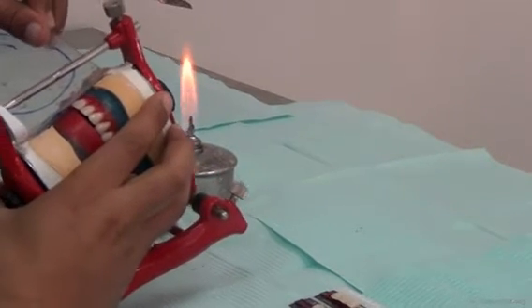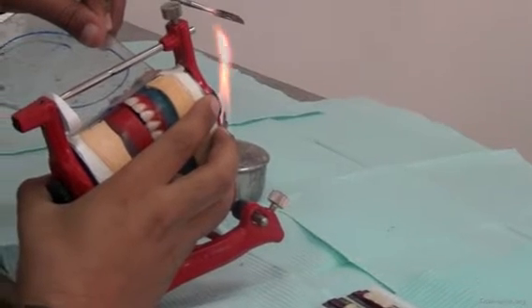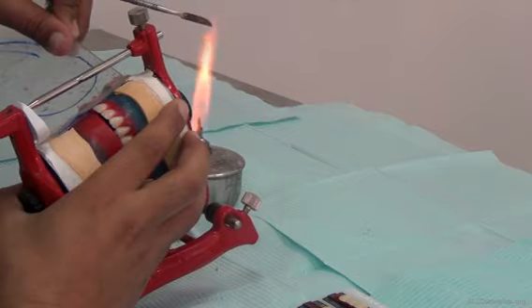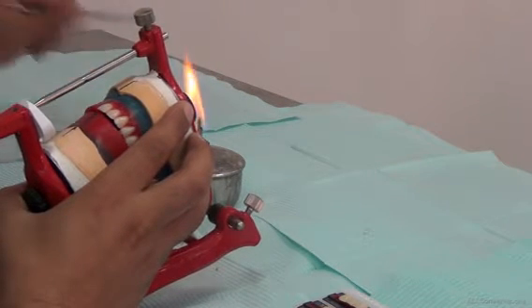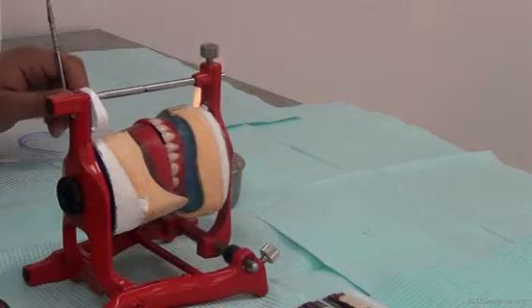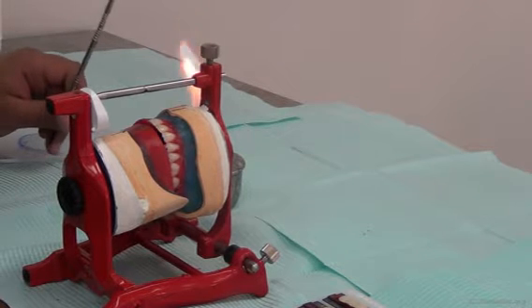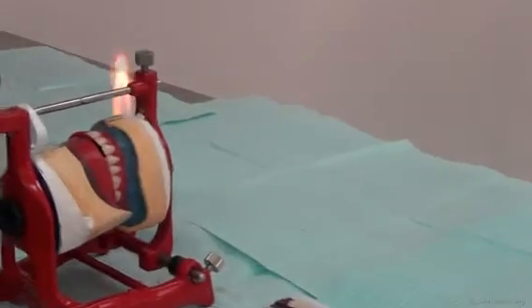As we told you in the first video, we are going to use cast-to-cast midlines as reference for your training, to overcome any problems with the articulator or any problems in your clinical skills in determining or drawing the midlines on the wax. And second, because the wax will be molten, we will lose the midline on the wax. So we make sure that our reference for the midline is the cast-to-cast relation. Now we're going to begin setting the teeth.